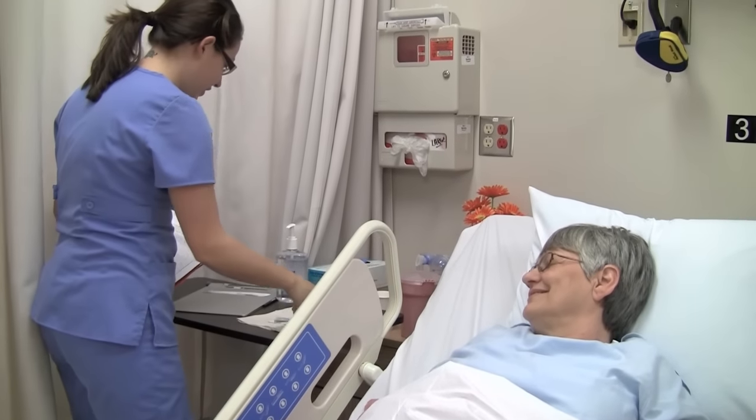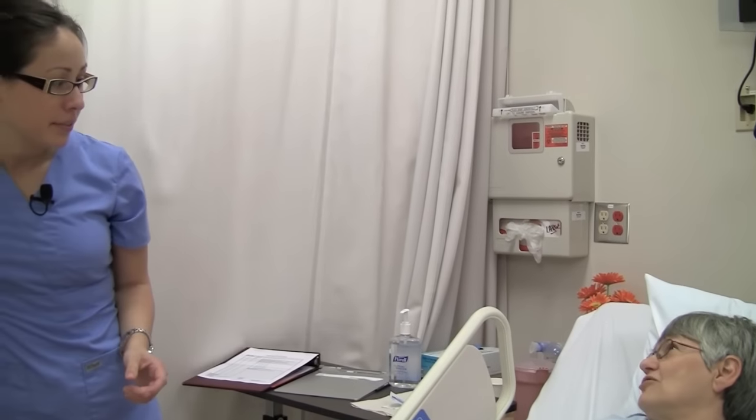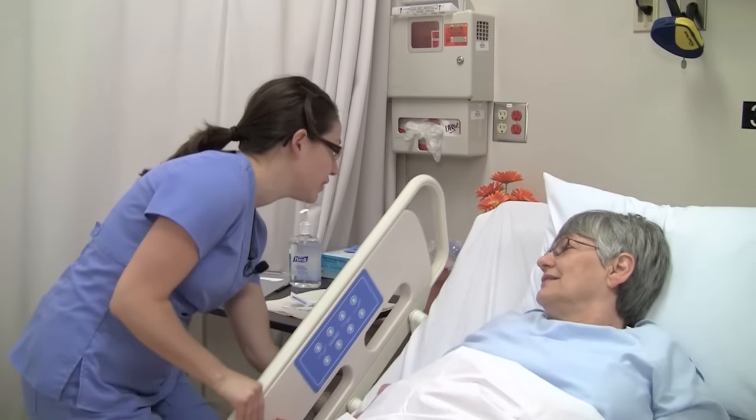Recheck the patient's ID and create privacy. I'd like you to please tell me your full name and date of birth. Alma Jones, 2-6-38. Thank you. I'm just going to lower this side rail here.